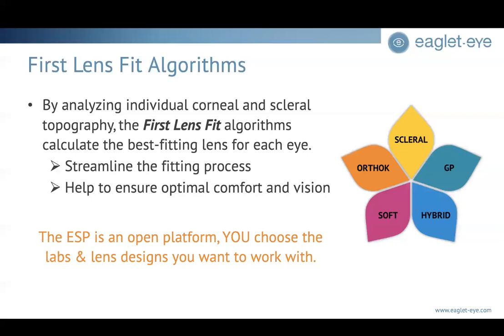And the cool thing about ESP, honestly, through many years of working with lots of different devices, is that we have such a community. And the really fun thing for me, in particular with the ESP, is the teamwork. The unit really is an open platform. With ESP, there is not just one design that you have to use. If you are a fitter that has a good relationship with a lab, there's a good chance that there's going to be an option for you to work within the software with the lab of choice.